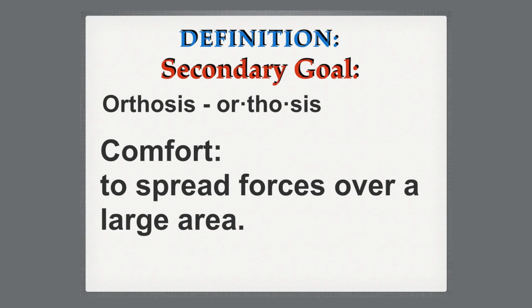So the secondary goal of an orthosis is comfort. Okay, so a person will not wear a device unless we can make that brace tolerable to support that body segment. If it hurts too much or whatever, it's uncomfortable, then they will not wear it. And our job is to support, protect, and all the things that we just mentioned before.